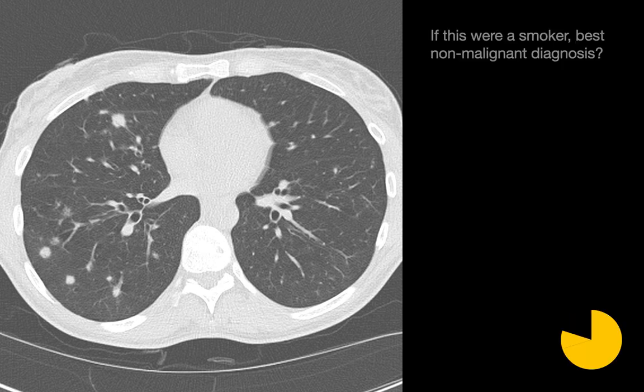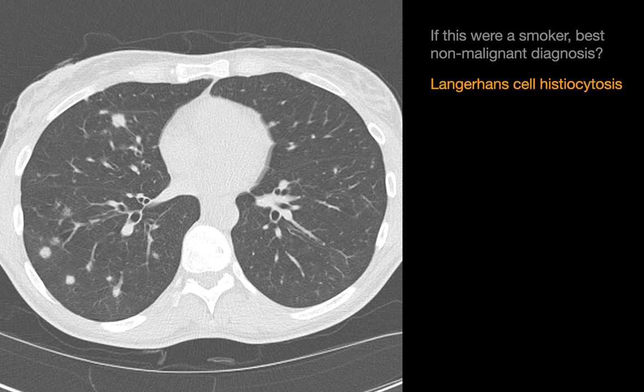If this were a smoker, what would your best non-malignant diagnosis be? In this case, we see numerous solid lung nodules of varying size, though the largest ones are probably topping out at just about one centimeter. Normally if we see this, we'd think metastatic disease first, but if we're looking at non-malignant diagnoses, especially in a smoker, one of the first things we'd have to think about would be Langerhans cell histiocytosis, or PLCH.